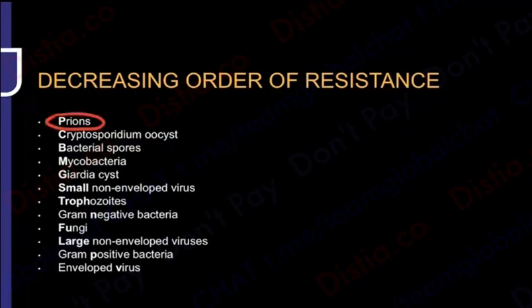So for prions there are a lot of methods that have been mentioned, but I'll give you the basics we have for inactivation. Prions, if you study in virology, I have covered at the end, and you have also covered in pathology, can spread via neurosurgeries, right? So anything that has come in contact with the brain, any kind of surgical instrument, is obviously a critical device.